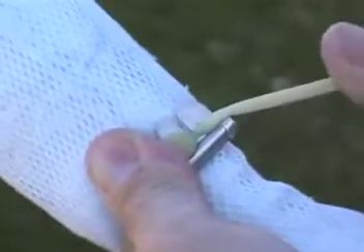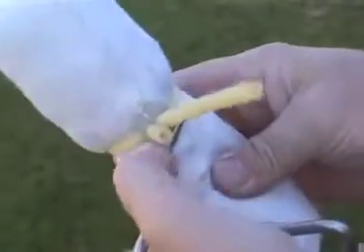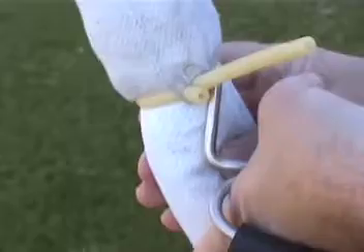It's as simple as that. You're done. To release the clip, you tip the tool forward and the clip slips out of the groove.